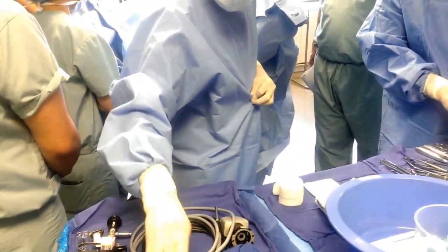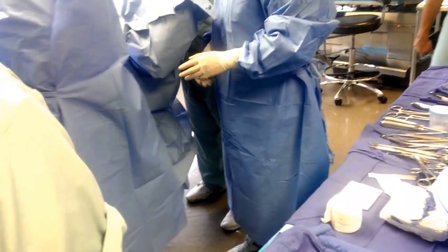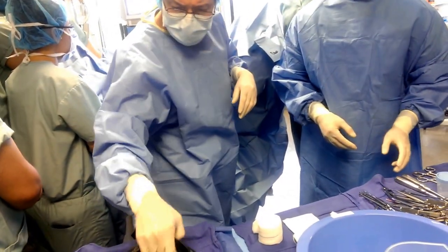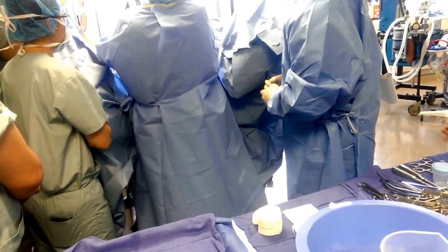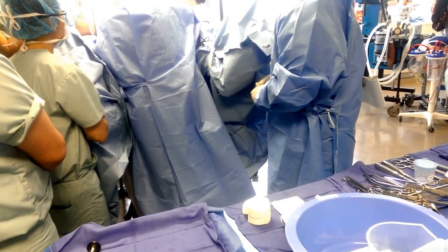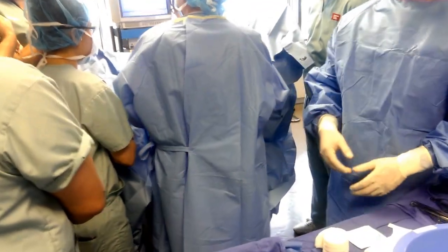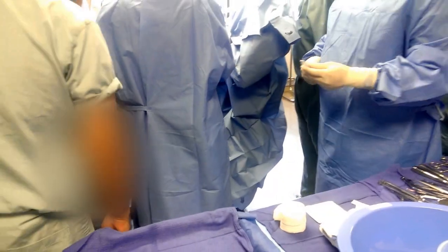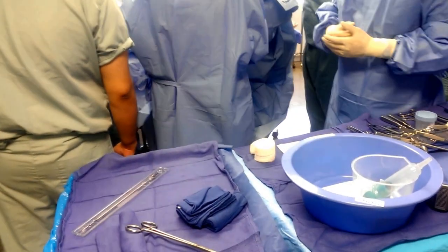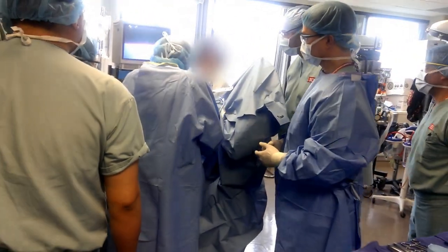Okay, let's go with the resectoscope. Just slide it in there. Oh, I can't see. So I have the loop. You see the loop? I'm going to hook it to the cautery cord, right? The cautery cord goes to the Bovie machine. I'm going to have a pedal to activate the electrode. So camera head, slicer.